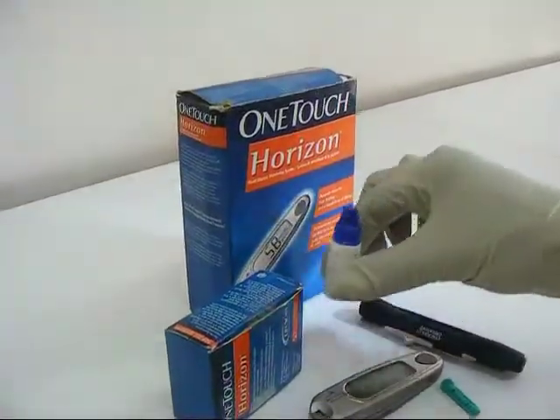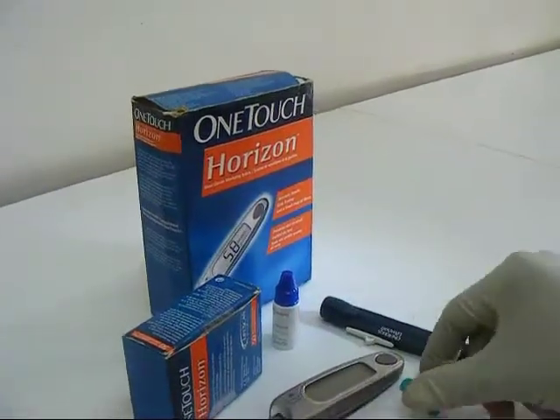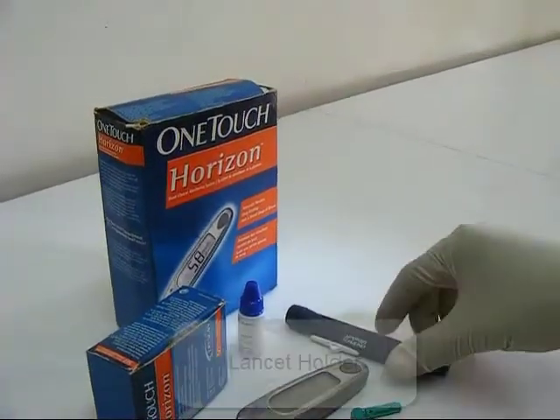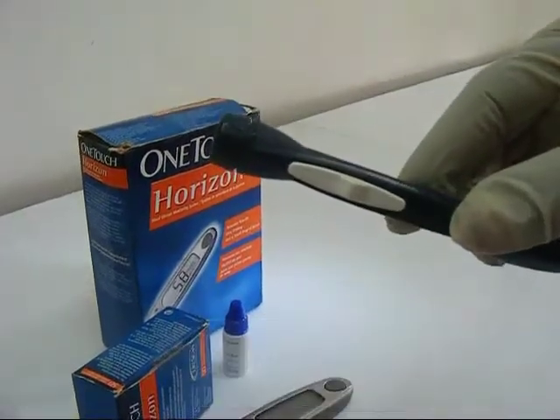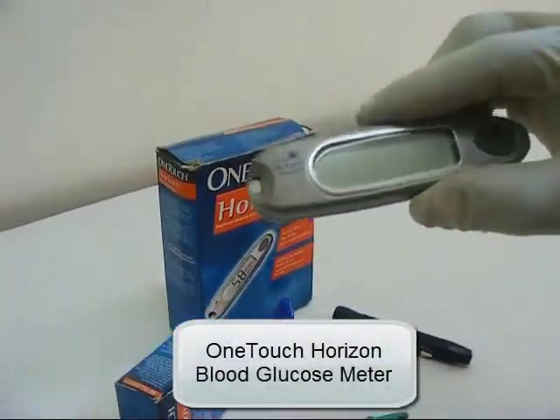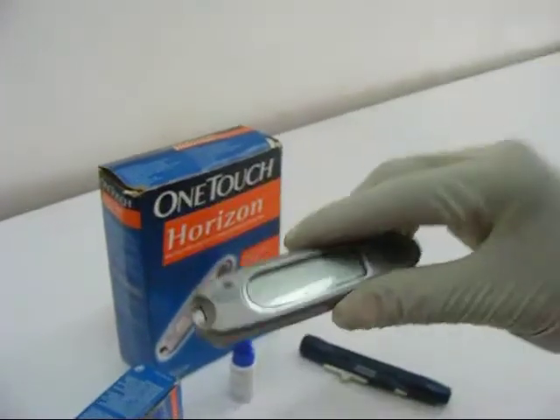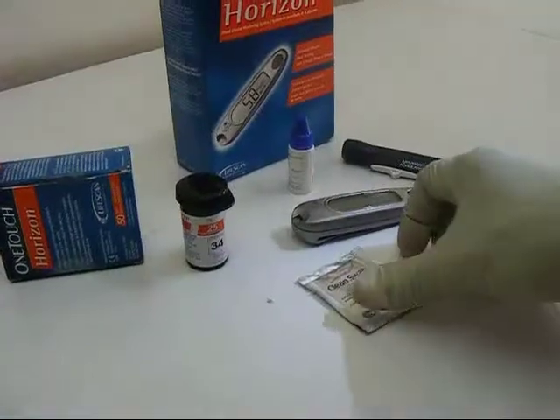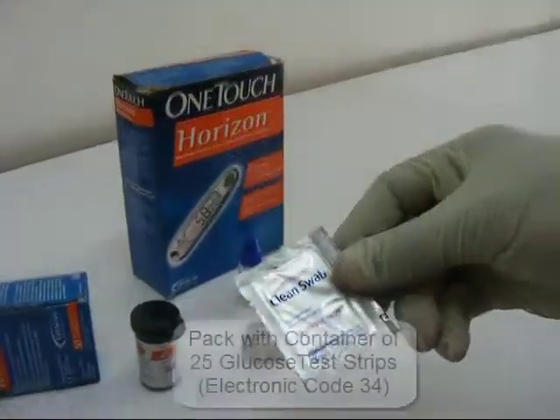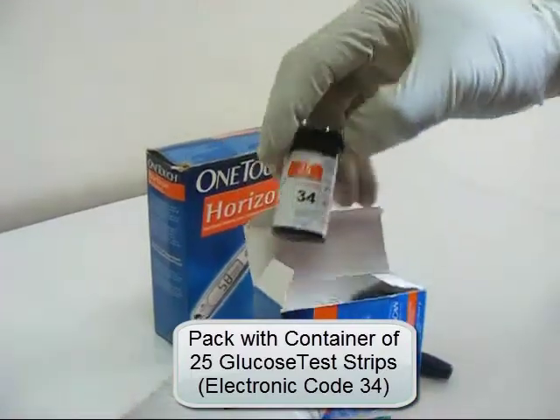The One Touch glucose monitoring kit consists of a One Touch Ultra control solution, a lancet holder, a One Touch Horizon blood glucose meter, a clean alcohol swab, and a pack which has a container with 25 glucose test strips of electronic code 34.